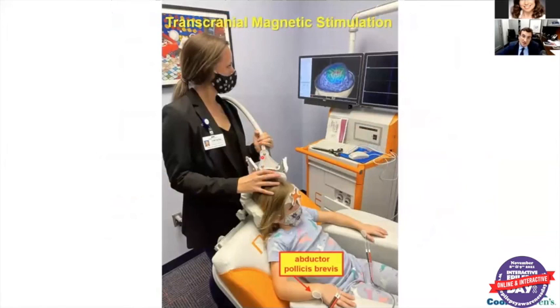This is the coil, and my colleague places the coil next to the child's head, and we stimulate the motor cortex, and we see how the responses can be recorded from the muscles on the periphery. So by using this technique, we see here how a map looks like. Before epilepsy surgery, we're also able to map the area of the brain which is responsible for the different motor functions of the child.